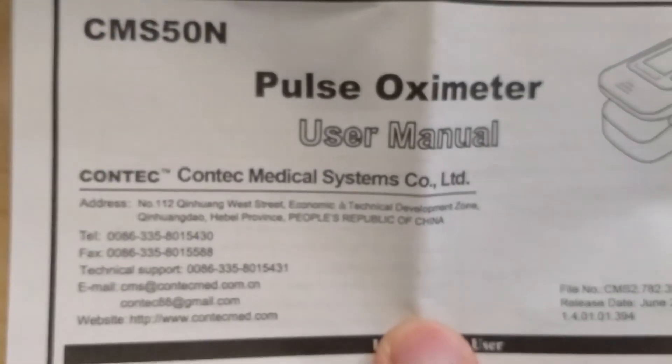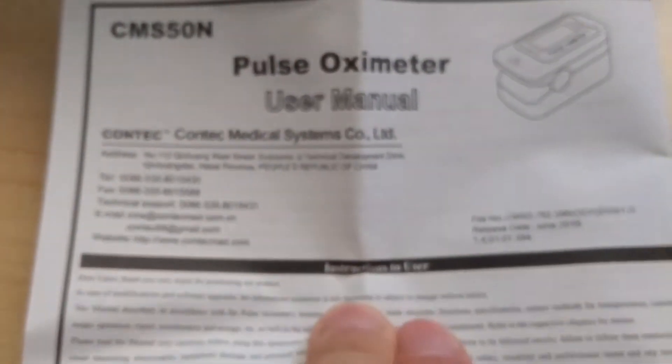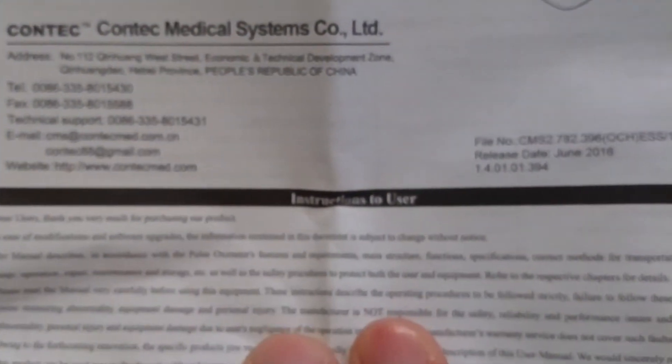Here's the manual. This is definitely a good read if you're interested in knowing the theory of how an oximeter works. The most important thing about reading the manual is probably the operating instructions — you want to have accurate results, so you want to follow the instructions appropriately.